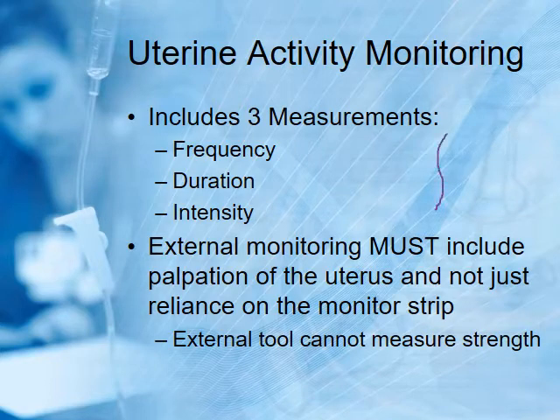External monitoring, there's the uterus and the baby. If you guys are tired of this, I'm sorry, but it's the only way I know how to do this. Okay. Whoops, the arm got out of the uterus. All right, so the monitor is going to go up here on the mom's abdomen, right at the top of the fundus, wherever it's the firmest spot. So that's where the external monitor will be.